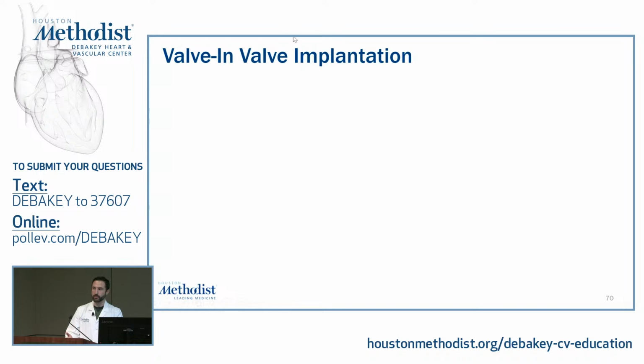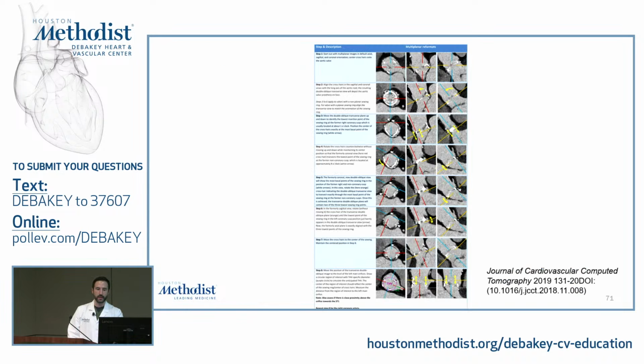TAVR has also been approved, as you know, for valve-in-valve procedures. And so in that case, CT for TAVR is very important to look at the feasibility of putting in a valve in that TAVR valve. So that's the importance of CT for guiding procedural access and procedural feasibility.